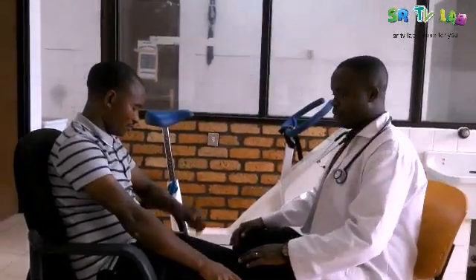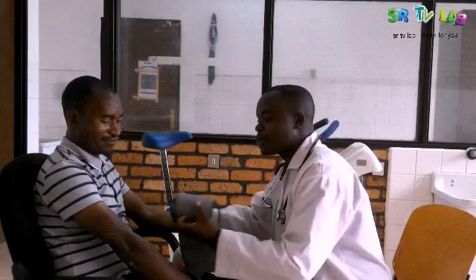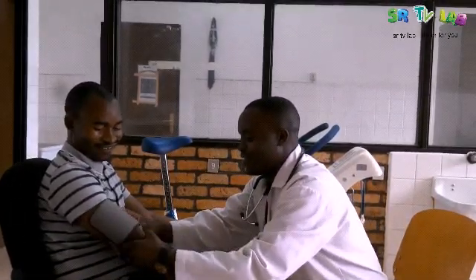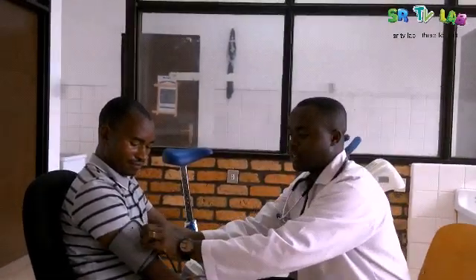Let's see blood pressure in the seated position. We are going to check the blood pressure. You see, when you are measuring the blood pressure, the cuff goes just two inches above the antecubital fossa — above the elbow.